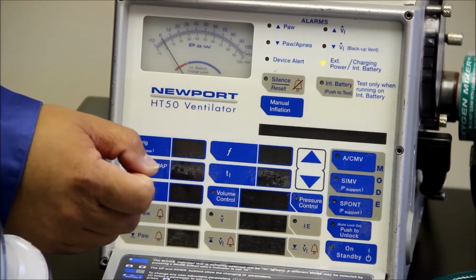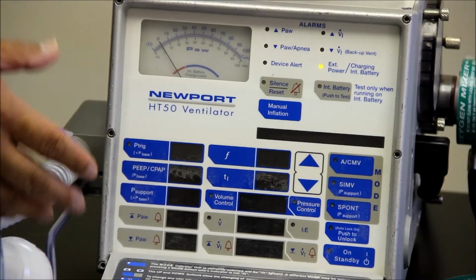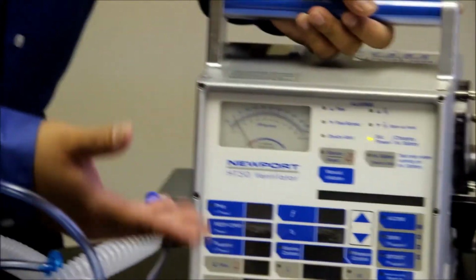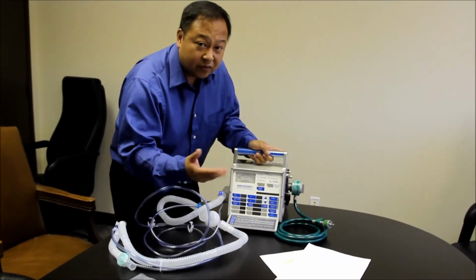And as mentioned before, I'm going to be talking about volume control, because volume control is what we use most often. Okay, so you'll hear this a lot: patients on AC of 12 with a tidal volume of 400, PEEP of 5, and maybe oxygen of 30%.